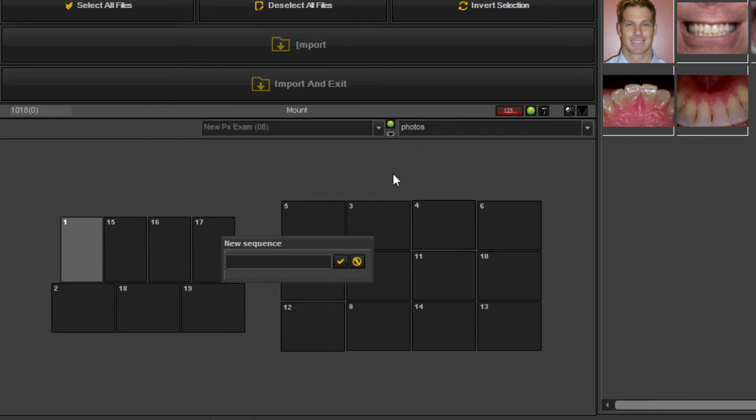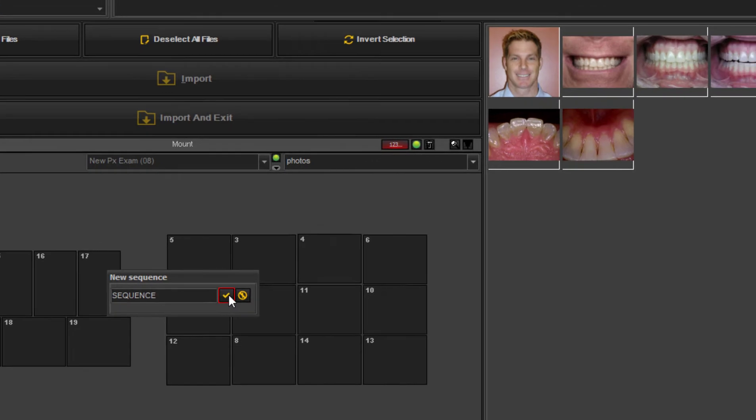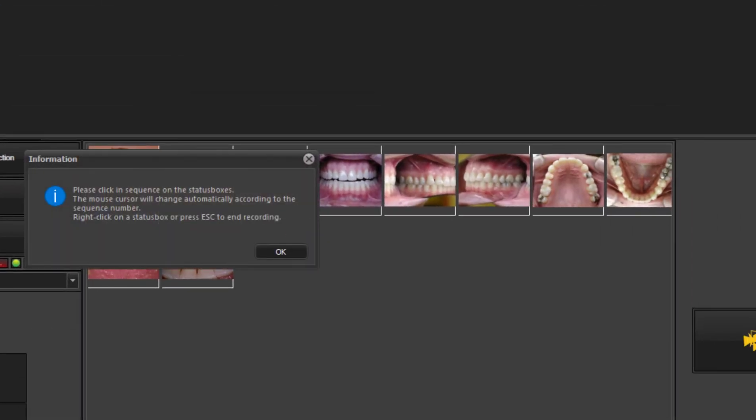Add a record of sequence. You can type in whatever you'd like that to be. Click the checkmark to save. The computer will tell you, okay, tell me what the sequence is. Hit escape on the keyboard and it will be saved.